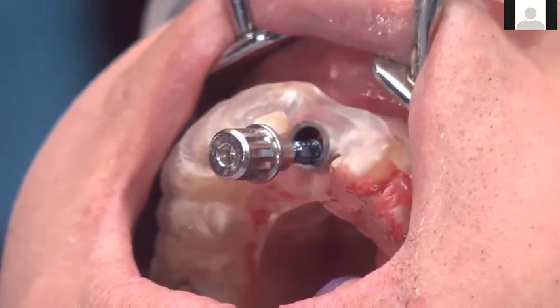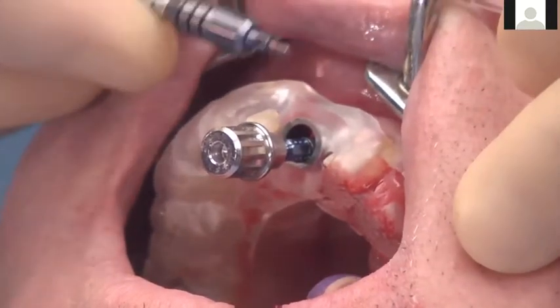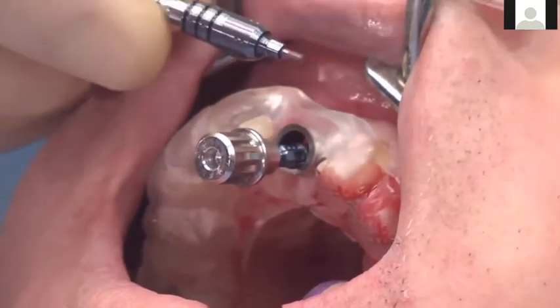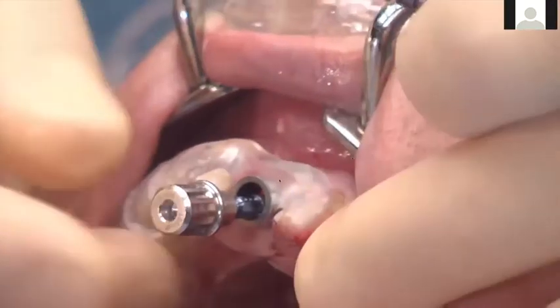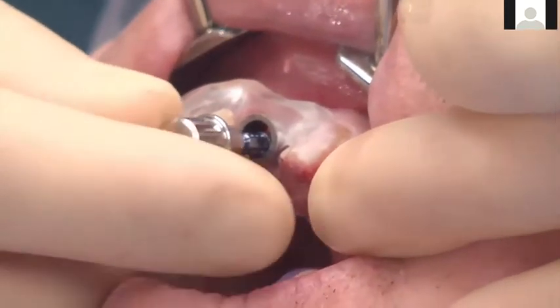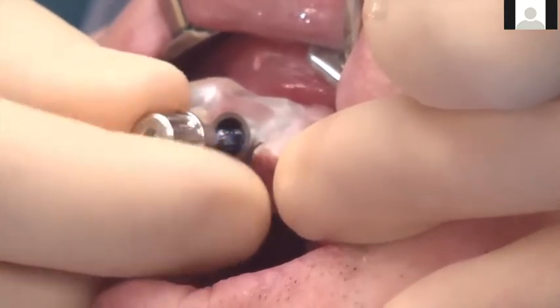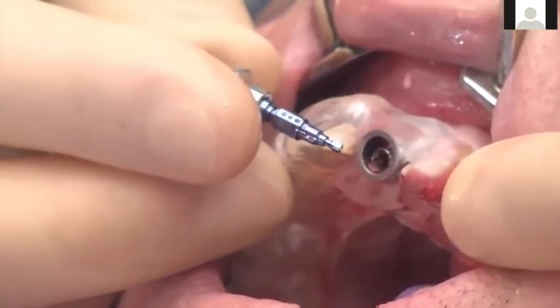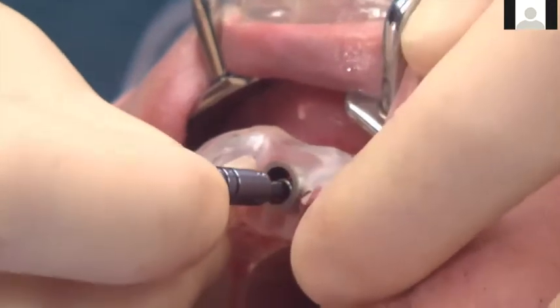Or there's a new mount driver that makes this actually easier, so you don't even have to buy those guided mounts anymore. This is a guided mount that we kept from some old surgery, re-sterilized it, and now we can take the non-guided mount off. Here you can see this is the non-guided locks and mount. We can just take that off. The implant is semi-stabilized in the osteotomy, just stabilized enough so that you don't pull it out as you're changing these mounts. So here we pull that out, and this is the locks and mount, and now we can go ahead and put the guided mount on, which then fully guides this. So this is one way to do it.